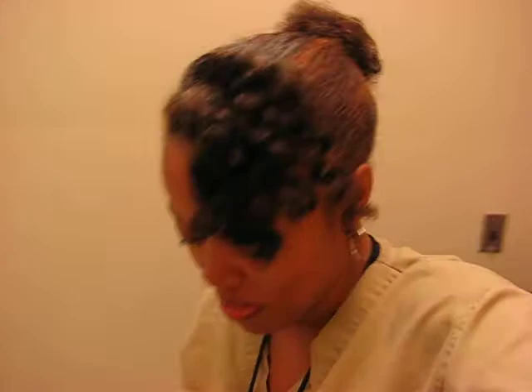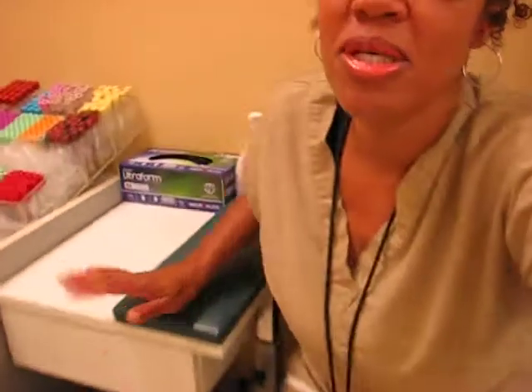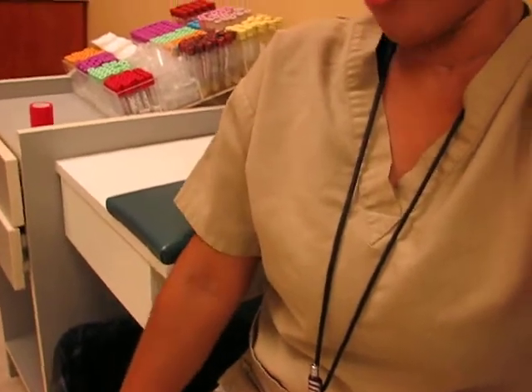Just a little tip this morning because I get a lot of questions about hard sticks and hard veins — how to find them. That's a way to find them. Let gravity help you. If you have a patient sitting in the chair, let gravity help you. You don't have to use these arms just because they're here — you have to adjust. Have the patient place their arm down, put the tourniquet on, palpate. You'll find it.